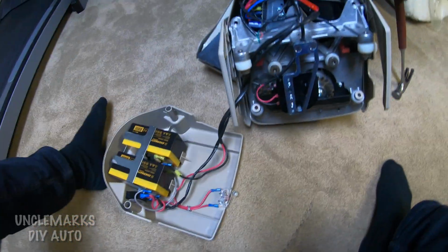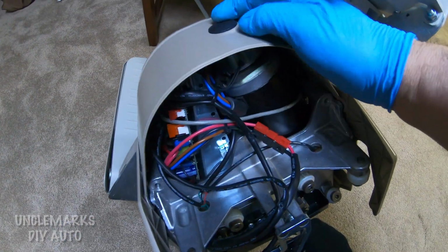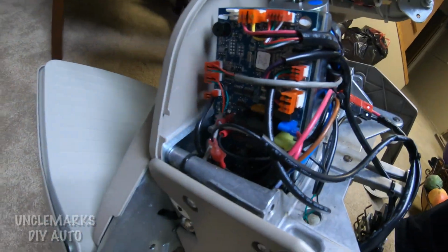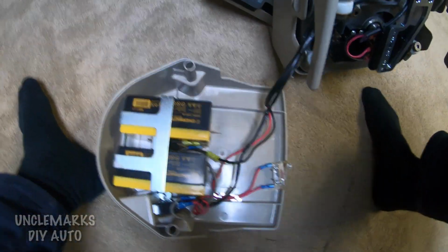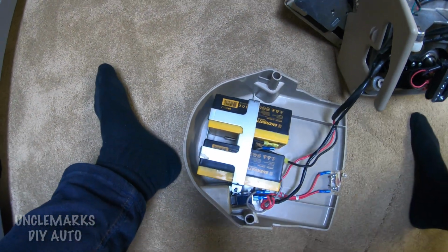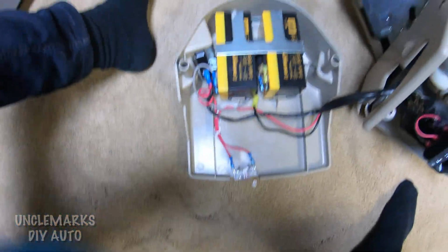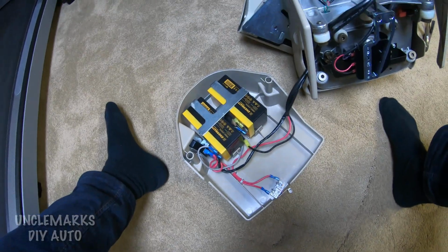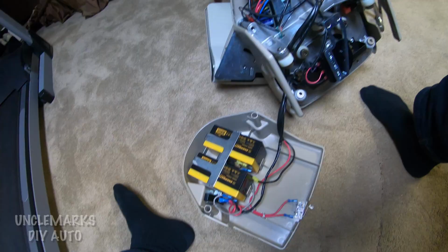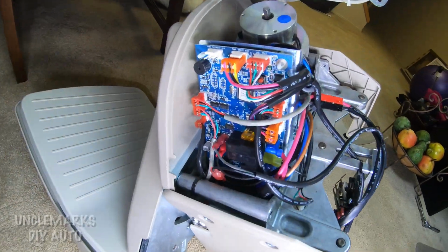I'm just going to set it aside. And if we can pull this other part off here, we see there's a motor and there's a circuit board. Interesting. Of course, with that micro switch there on the floor we're looking at, if you took the two wires off the switch and shorted them together, then it probably would deactivate or activate the switch so that it should work. You'd know if it was a switch or not that's not working. Of course, you could take a multimeter and check.